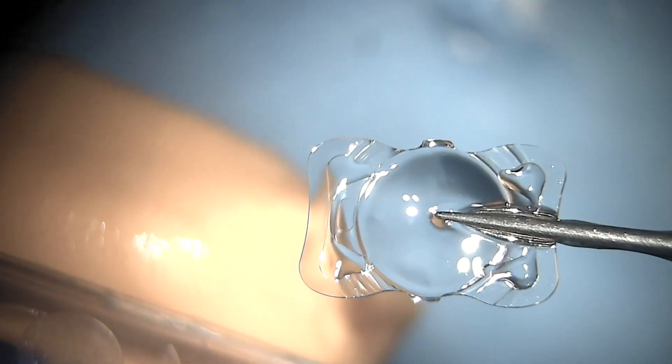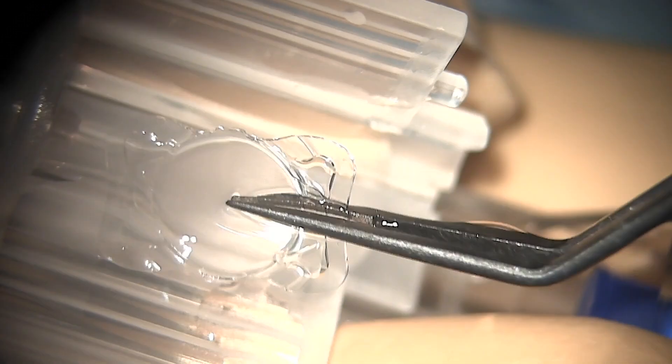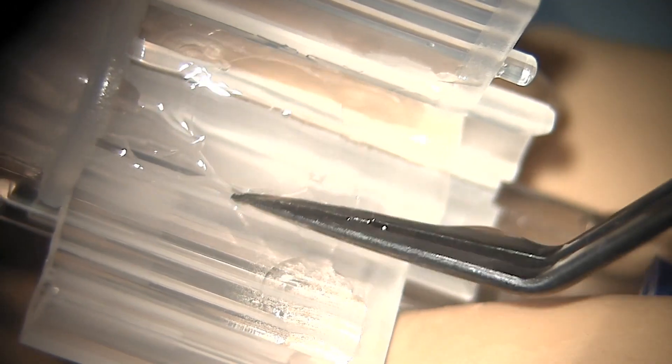Now you can see the lens is removed from the holder. You can see the notches on the lens — there are two notches on the lower side and one on the left upper side. The lens is placed into the cartridge in the same position, then pressed down so the cartridge is closed and loaded onto the injector.